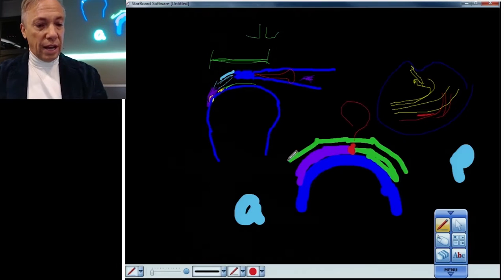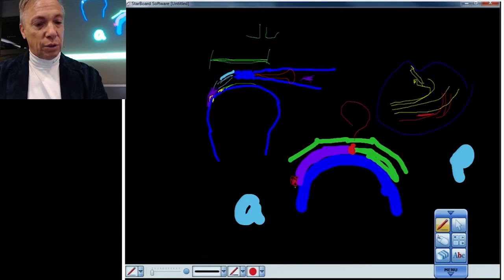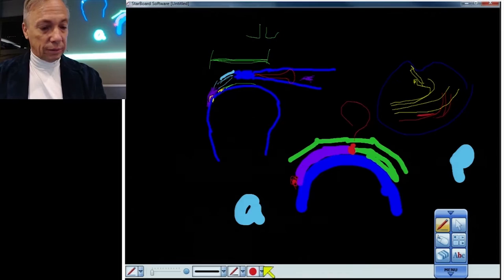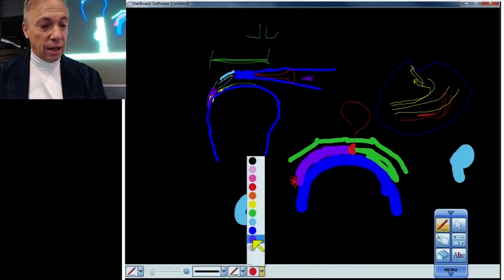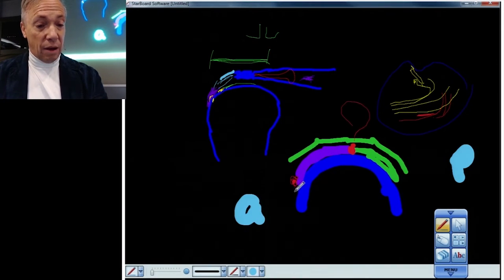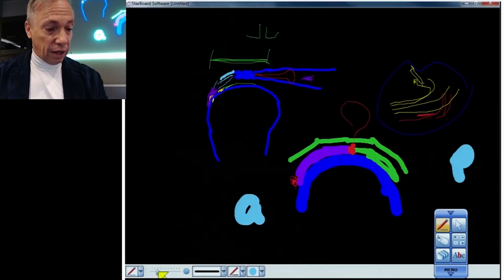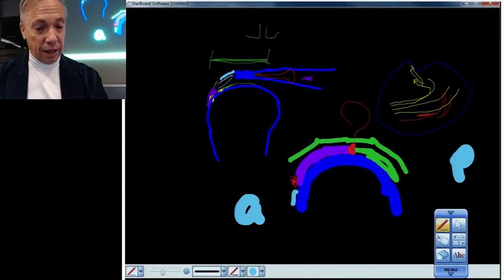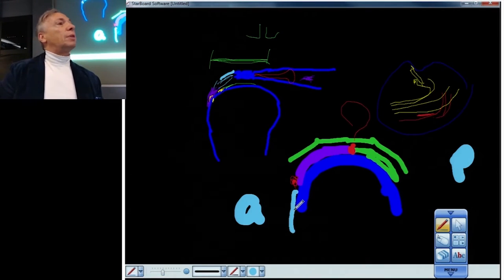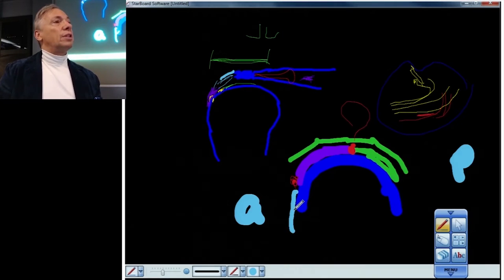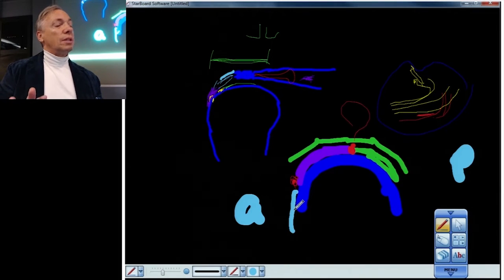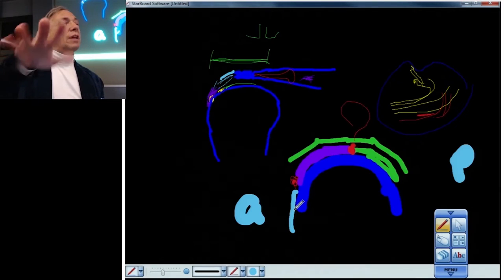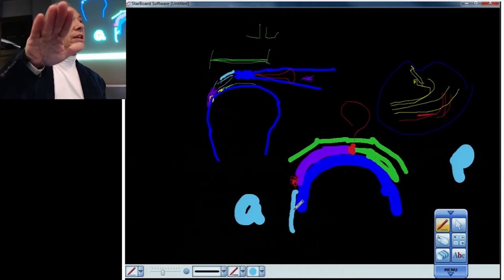There's an anterior interval right here. That's the space between the supraspinatus and the subscapularis, which we will make now in blue. We'll make it a lot thicker. Here's our subscapularis. And the subscapularis, unlike these other tendons that fan out and flatten out and blend together and make a mesh of low signal intensity almost like a net, the subscapularis doesn't do that.